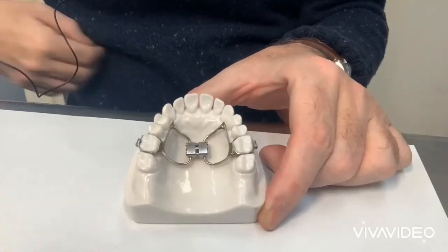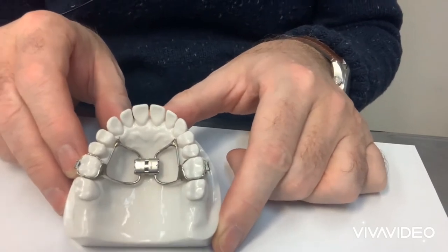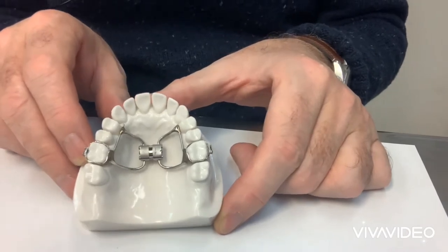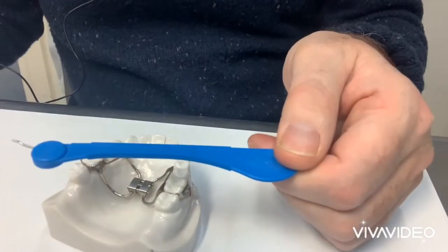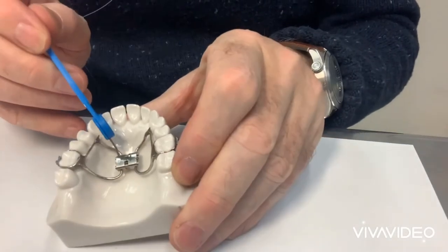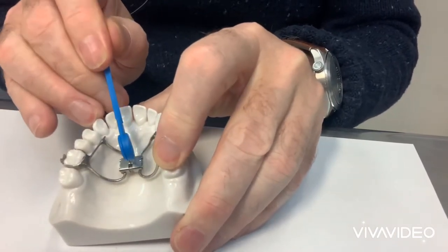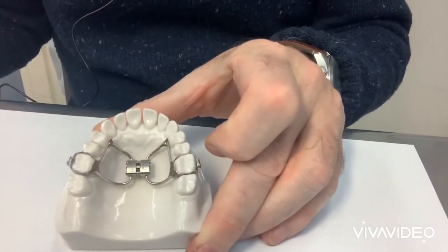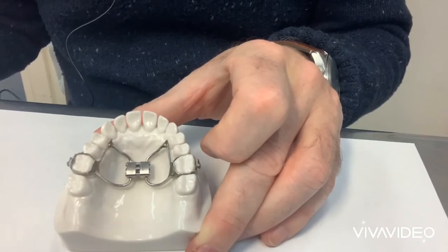This is the standard Hyrax screw. If you just write that you want a Hyrax or an RPE on the lab sheet, this is the screw that you will get. It is activated with a blue handle key — the patient, or the patient's parent, can put that in the patient's mouth, find the little hole, and just turn it. That's one turn per week, and one turn equals one quarter of a millimeter.